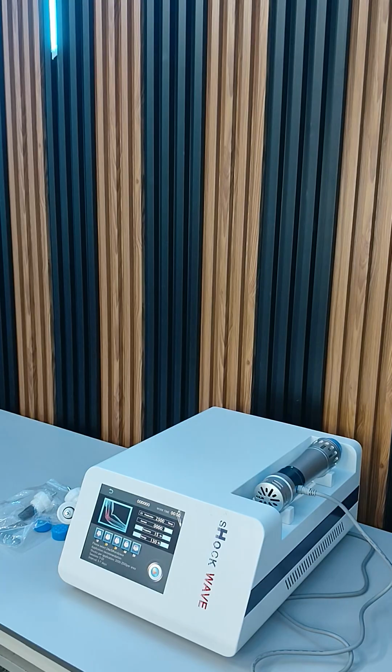So as you increase the frequency, if you select the maximum energy of 200, that may damage the joint. So if you increase the frequency, it will automatically adjust the maximum level of the energy.